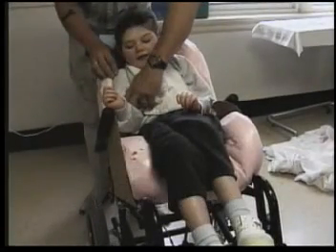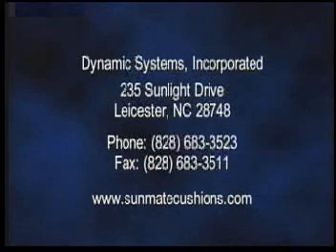The insert will be finished using a custom-sewn Rubitex cover.